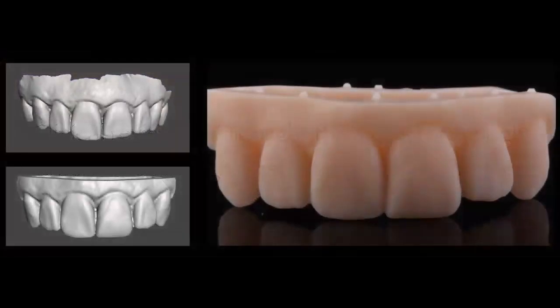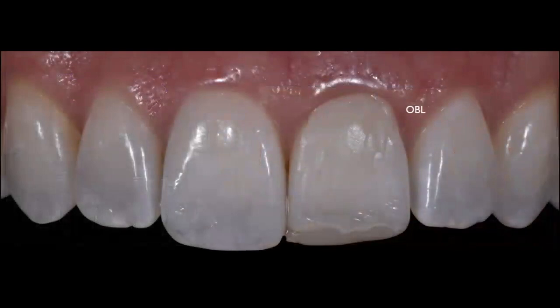So the first thing that I did was actually do a digital wax up, and this digital wax up was done just out of a scan. You can see again the lingualized position of tooth number 9 compared to tooth number 8. So I added a digital tooth onto that site, and that gave me that bulkiness that I needed towards the facial. Once I placed that digital tooth on my scan in the right position, I 3D printed the model, and out of that 3D print I created a lingual matrix, and that is what I was going to use in order for me to get the right length and the right incisal edge anatomy and location.